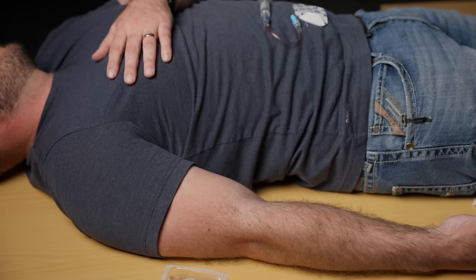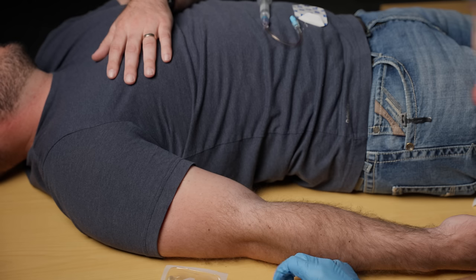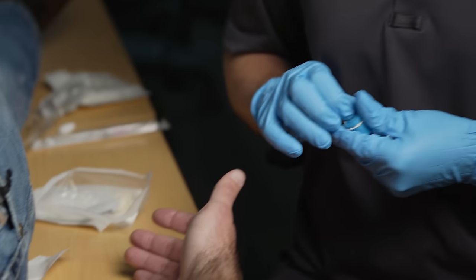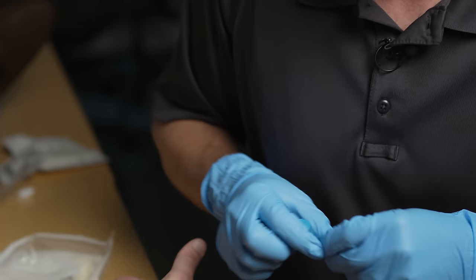I'm going to get my tape set up — I like peeling two strips and just sticking them to the edge of the table. This is going to allow me to secure that IV, and I've got the extra tape right there just in case. I've got my gauze pads in case I miss or need to mop up some blood, and I've got the venous tourniquet and my IV catheter.